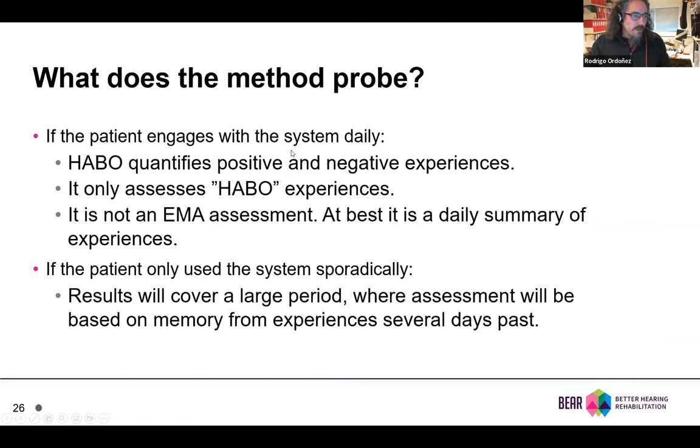So what does the method probe? Well, if the patient engages with the system daily, then we can quantify both positive and negative experience. So we have an idea of how many times the person had positive and negative experiences. And by knowing which ones they said they experienced, then we can have an idea of the context in which this experience took place. Not knowing all the details, as with the sound measurements, like Josefina was telling, or other contextual contexts for the given assessment, but we have an idea.